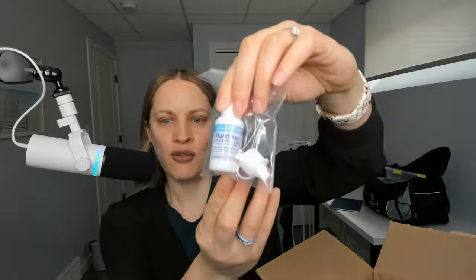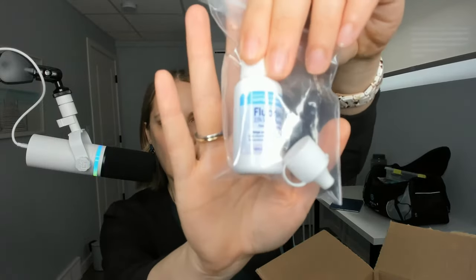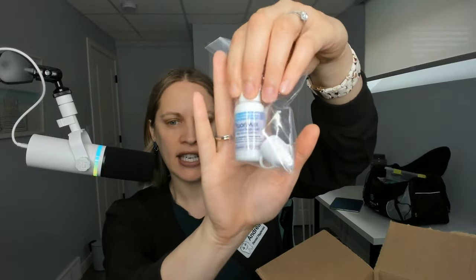I'm trying a new fluoride varnish — this one's cotton candy. I have ordered from them before; I used to get the salted caramel fluoride varnish. I love it. It goes on so easily, your client can eat and drink right away, it's not sticky, it's amazing stuff. I'm trying the cotton candy, so I'll let you guys know what that's like.